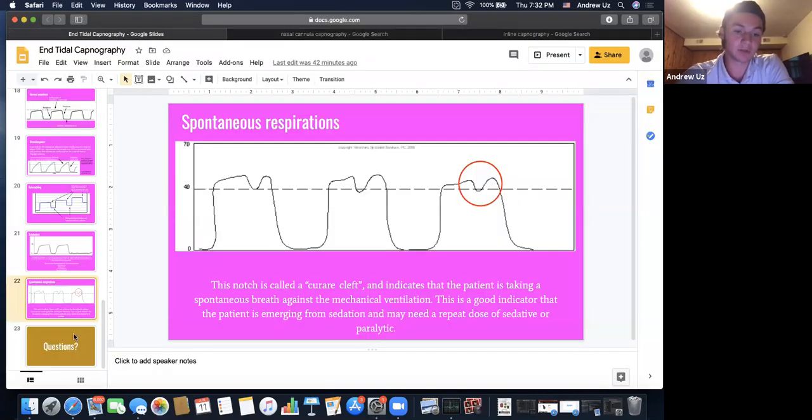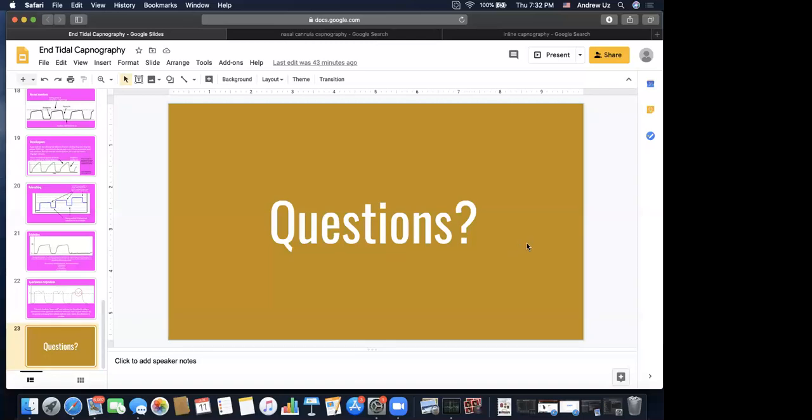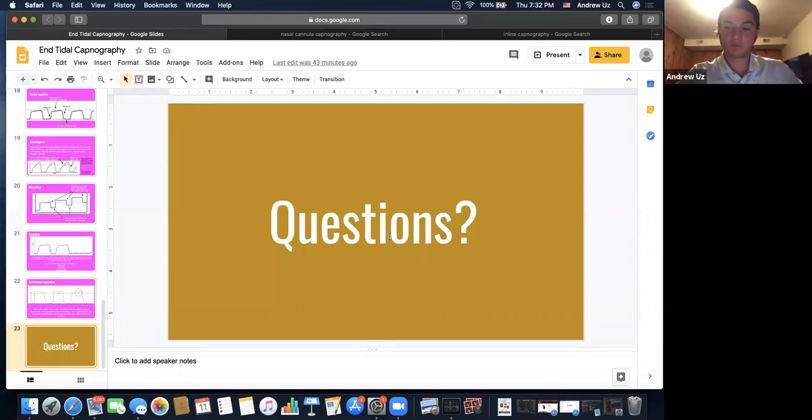So at this point, we can open it up for questions if anybody has anything. Andrew, this might be a stupid question, but you were talking about the spontaneous breathing. Sure. You can't take the tube out, correct? Well, it's a decision for the medic to make. I don't believe in hardly ever doing that. I think if you had to intubate them, they should probably stay intubated.